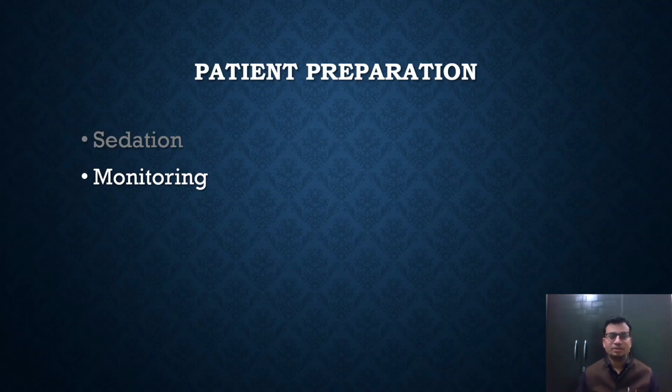Then attach the monitor on the patient and keep vitals checking like ECG, heart rate, blood pressure, SpO2, etc. Note the baseline value. For blood pressure, I would suggest to start NIBP, that is non-invasive blood pressure monitoring, cycle at every 2 to 3 minutes till you have started the patient on mechanical ventilation. Then you may keep the NIBP cycling set at every 10 to 15 minutes or so. This will help you to detect the post-intubation hypotension early.